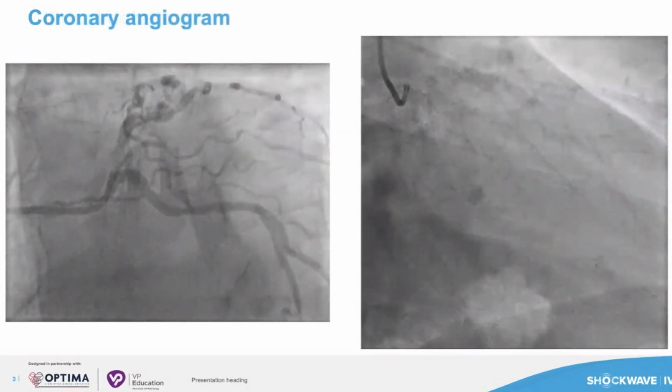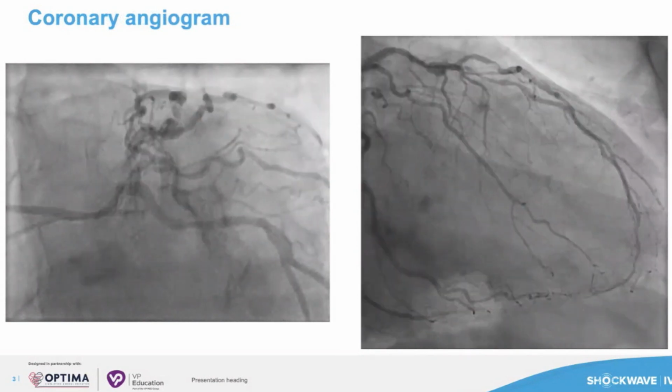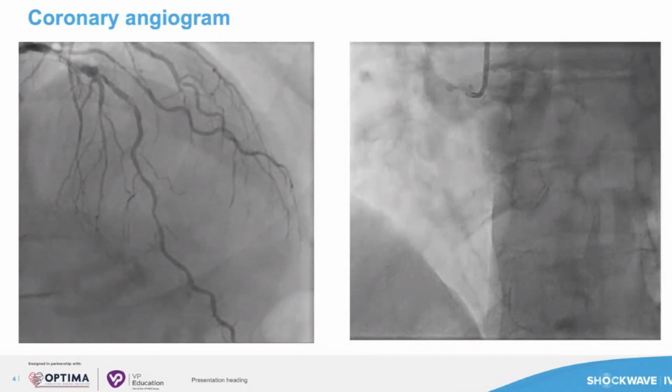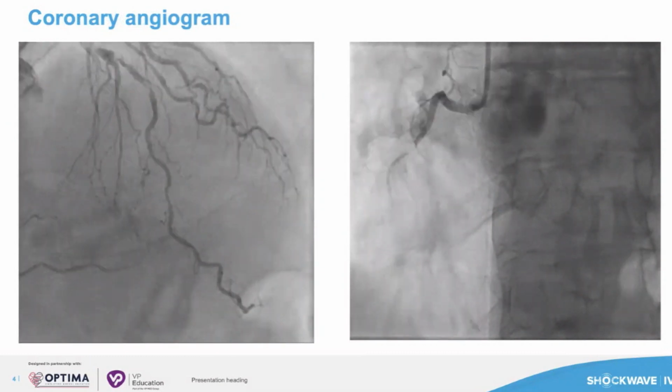So this is his coronary angiogram, which was performed last week. He has a calcified proximal LAD disease, and also a CTO of his right coronary artery. So we'll go back to the live pictures just now. Thanks, Novalia. That was very instructive. Looks like a tough case. Margaret, Claudia, we're with you now. Any thoughts on how you're going to take this forward? Looks like you've got a challenge on your hands there.